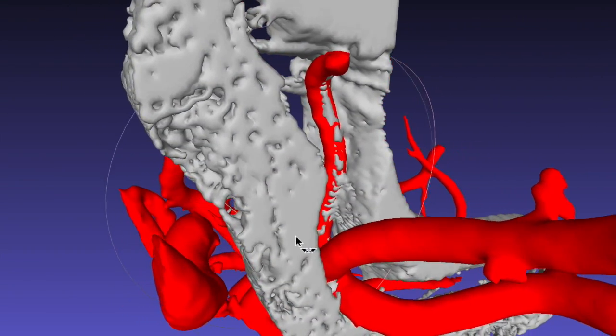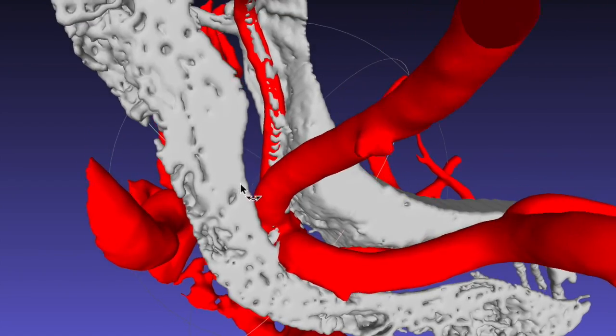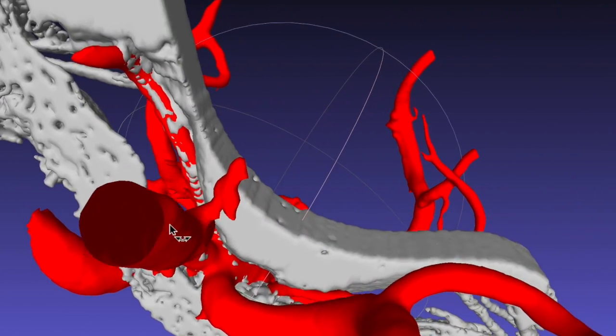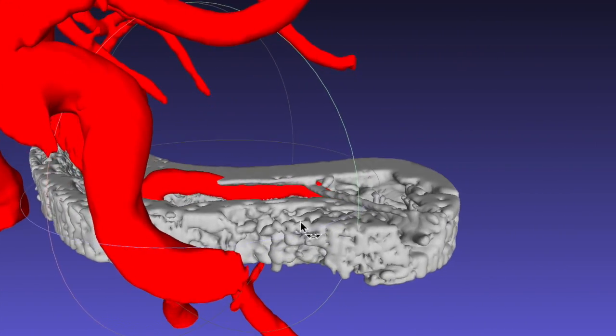These images show the compression of the attached segment of the left facial nerve in a patient with left hemifacial spasm. Note that the cisternal portion of the nerve is not compressed.